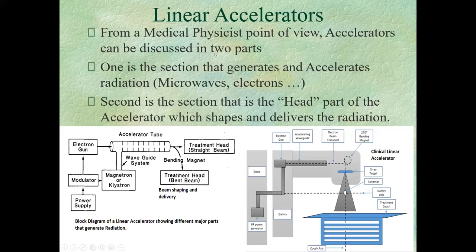So from a medical physics point of view, accelerators can be discussed in two parts. One is the section that generates and accelerates radiation, like we generate microwaves and then accelerate electrons with them. And the second section is the head part of the accelerator. So for those of you who are preparing for some kind of exams, sometimes you will get exam questions from the head part as well, talking about different positions of different options that we are going to discuss.